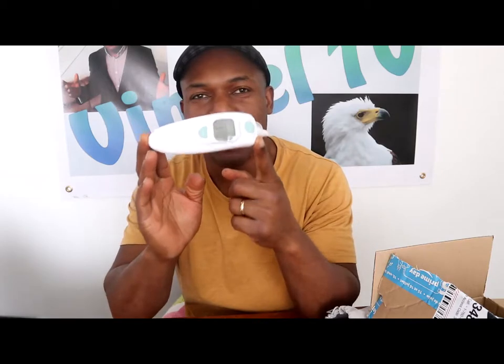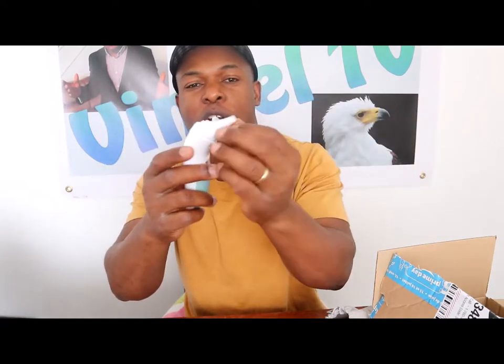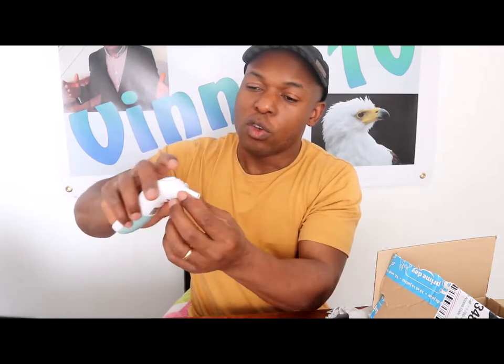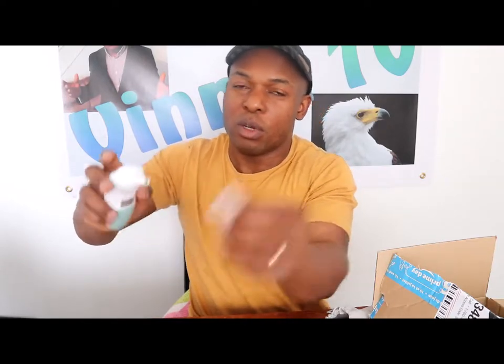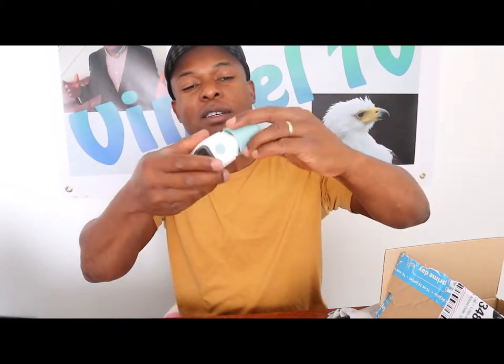Now it's reading 37 degrees. I just wanted to show you this thermometer — every family needs to have this at home. You can use it on your forehead, but this one is for the ear. To take it off, please remove the probe. To put it back on, press once — you'll hear the beep noise. It shows 37 degrees.